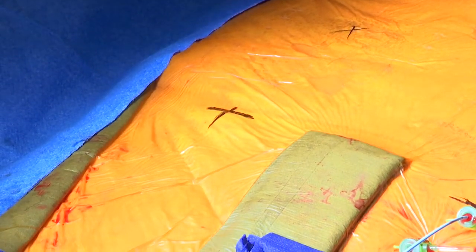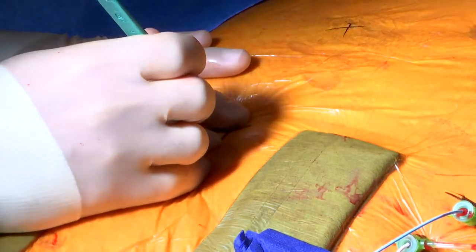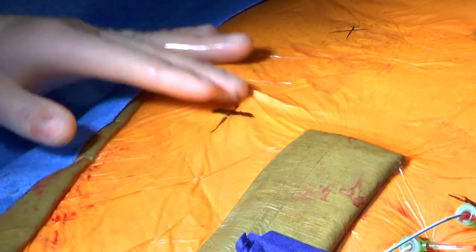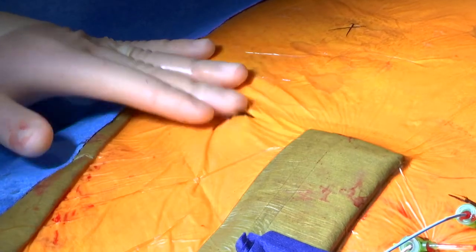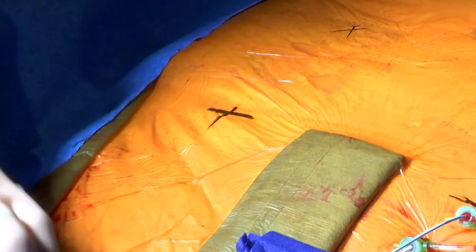So I'm going to use a little blade here. Just make a tiny incision. Just feel in the artery. There it is, right there. It's a pretty small incision, about a quarter of an inch wide. Then I'm going to take some Kelly clamps here, kind of stretch the tract like that. And then I'm going to get the access needle. Matthew, can I have the access needle? Thank you.